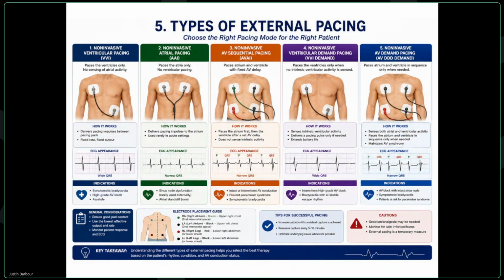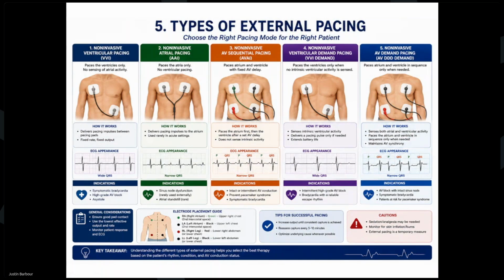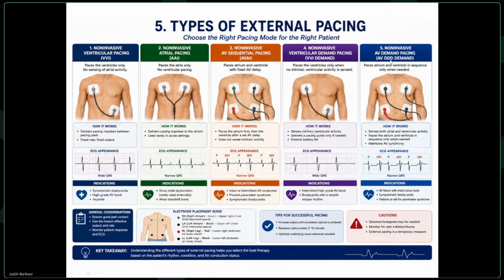And we have some different modes for external pacing, guys. And this is where things get really complex. We don't expect any of you guys to remember this stuff, but there are different modes that your clinical staff are going to use for pacing. And the important thing to understand about pacing is that there is demand and there's asynchronous pacing. So demand, it's looking for the heart to be trying to beat on its own or to be within a certain tolerance. And if it exceeds that tolerance, that's when the pacemaker takes over.